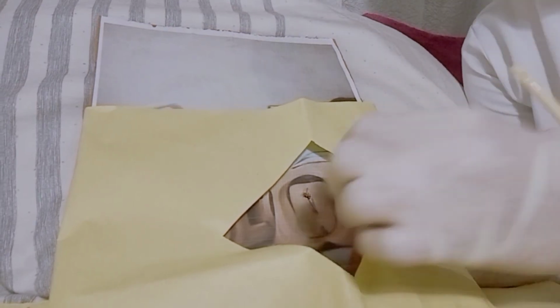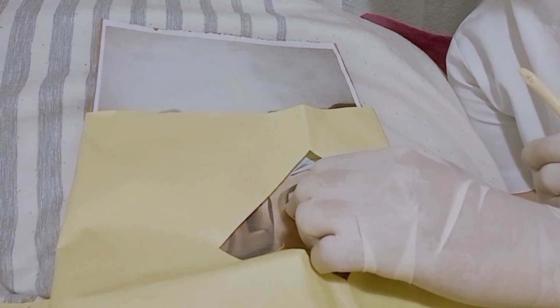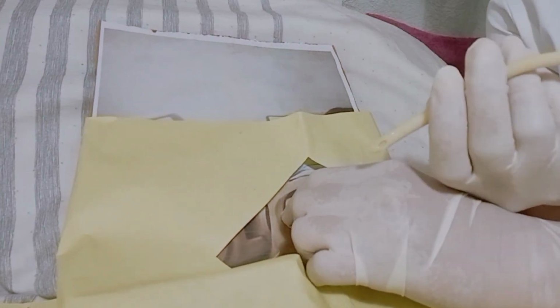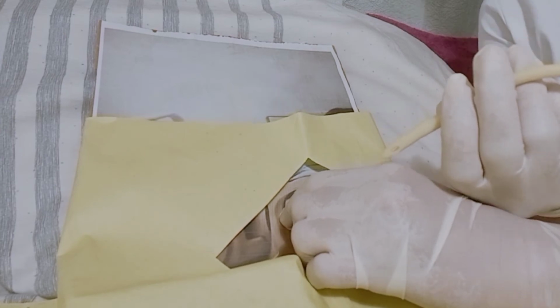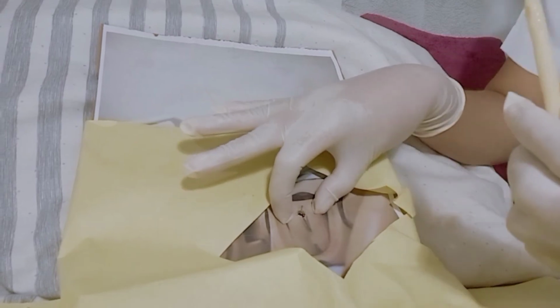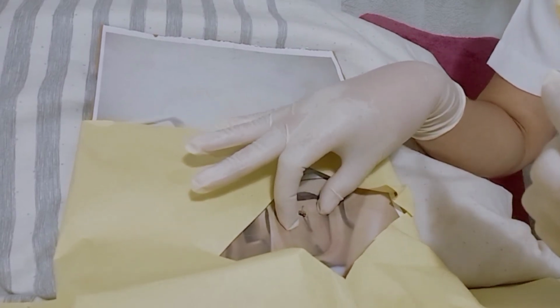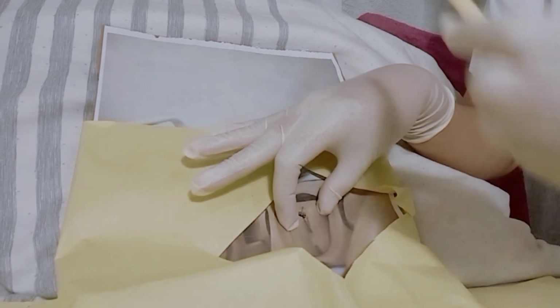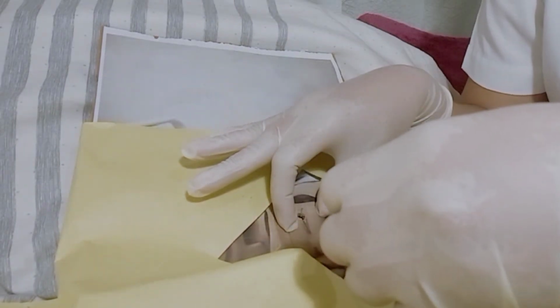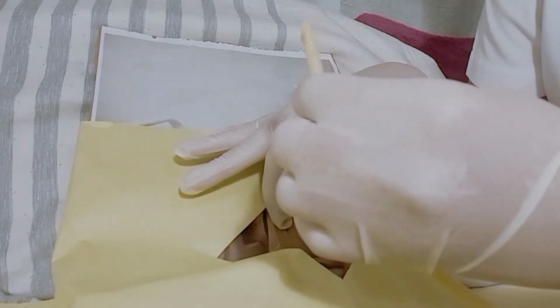Separate the labia minora and labia majora with your non-dominant hand and hold this position until the catheter is inserted. The dominant hand is the only sterile hand now. The non-dominant hand is contaminated and continues to separate the labia. The rationale is that this exposes the urethral opening.